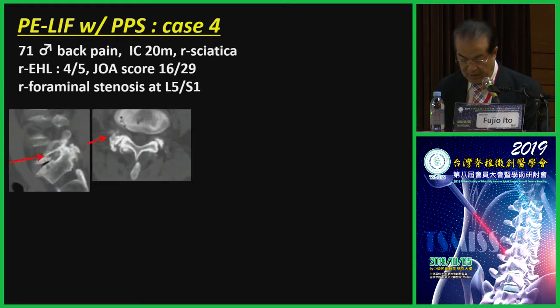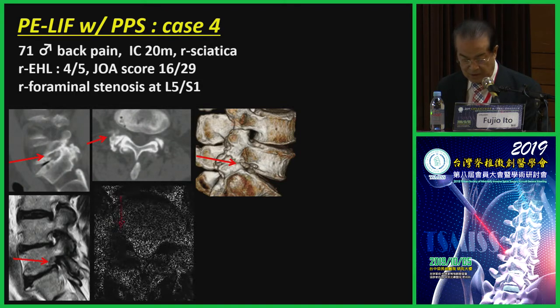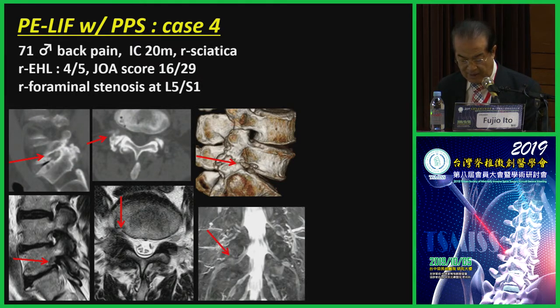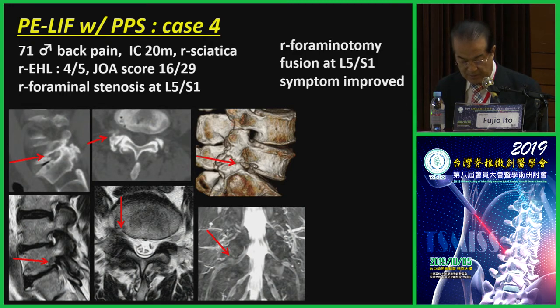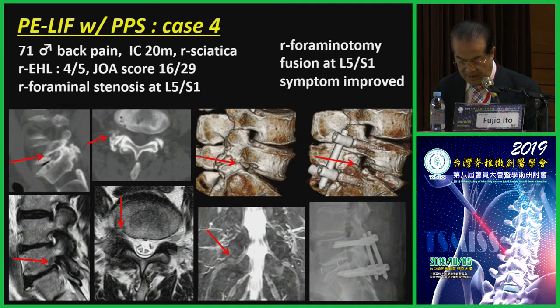CT showed right foraminal stenosis at L5-S1. MRI also showed the right L5 exiting root compressed. PE-LIF was performed. Right foraminotomy and insertion of the cage increased the vertical distance of the foramen.